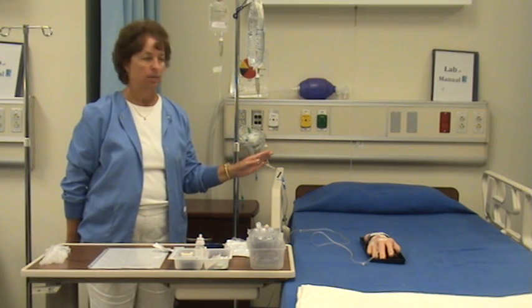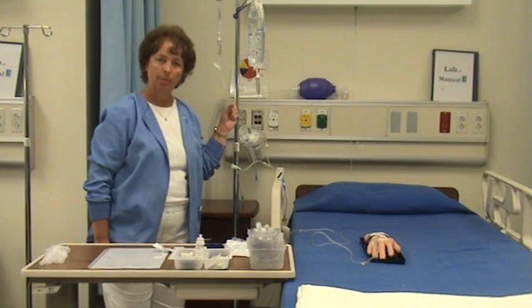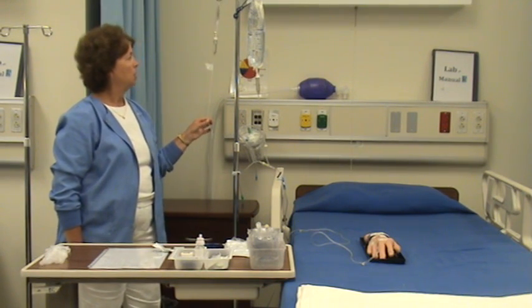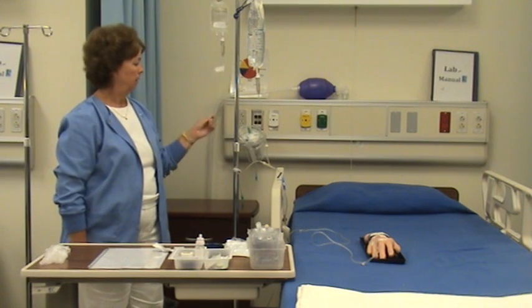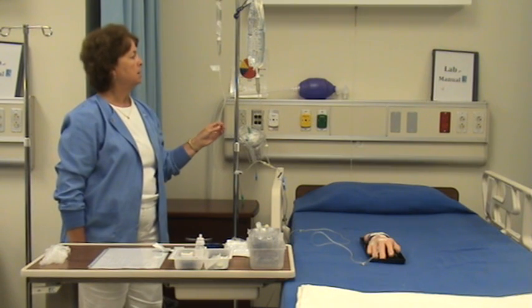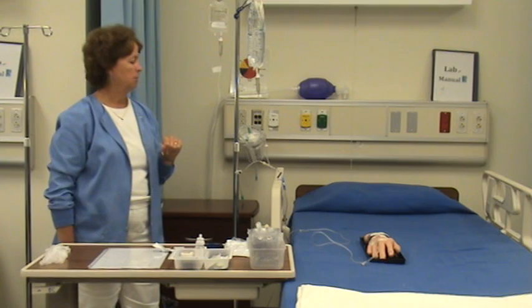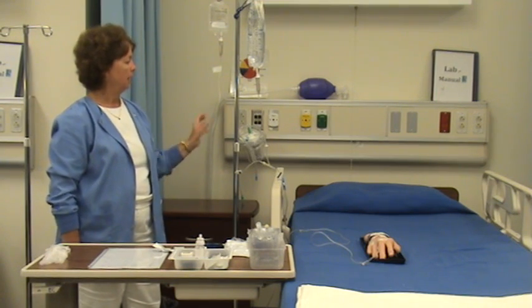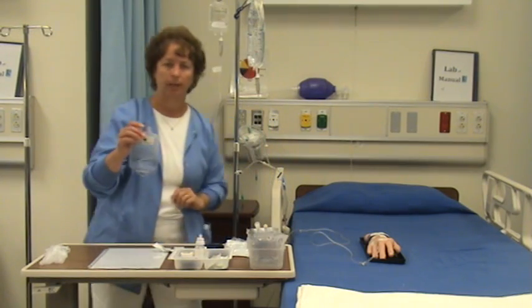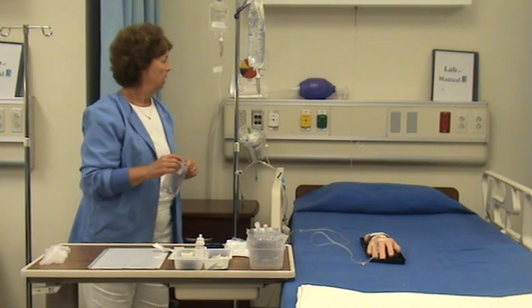I do want to show you one more thing. If you have multiple, usually IV piggybacks are every 8 hours or every 6 hours, if they're antibiotics. So in 8 hours, you're going to leave this hanging there because you're going to reuse this tubing. Some places do what they call a back flush or a back prime, and I just want to demonstrate that for you. Let's say that I'm coming in and I'm going to hang another antibiotic, either the same one or a different one after a few hours.